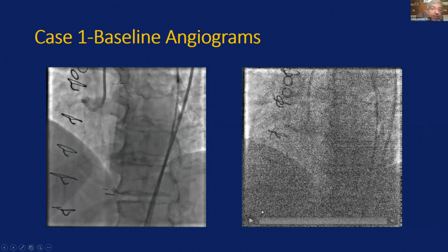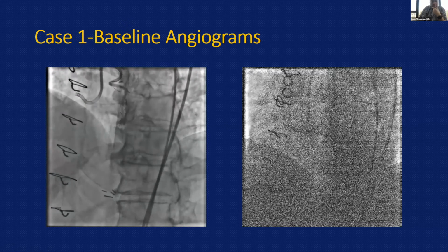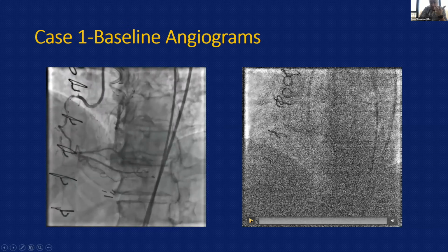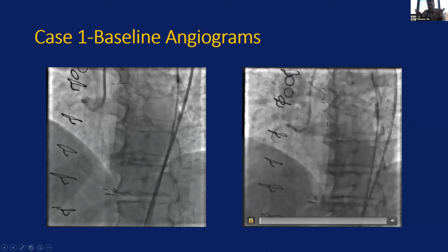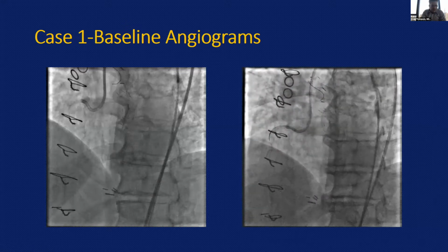Would any of the panelists disagree with this being a primary ADR/retrograde case? Not at all. I mean, you're weighing competing risk of using a high risk LIMA versus an alternative strategy that you just described. I think that's smarter. The scales tip you to doing what you're presenting, I think.